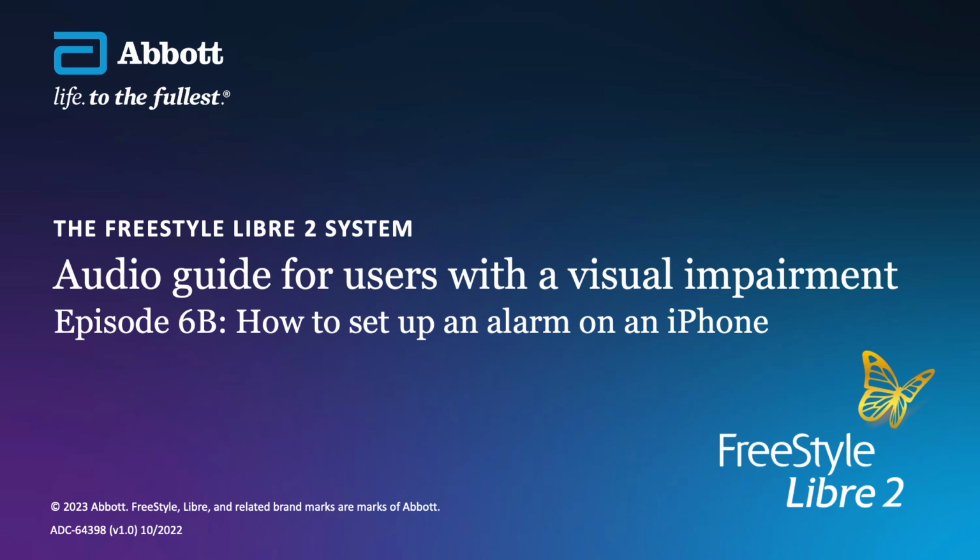The high glucose alarm is set to notify you when your glucose goes above 13.3 millimoles by default. The options available on this screen are the same as on the low glucose alarm screen.